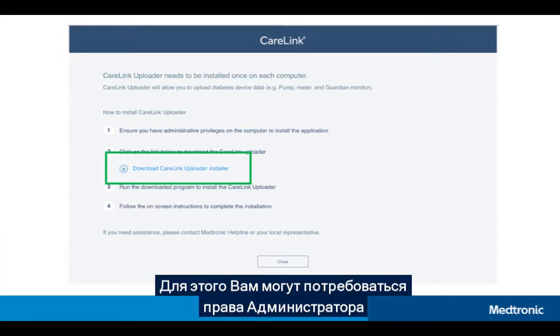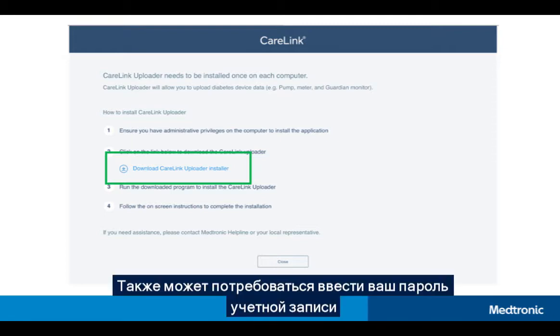You may need to have full access to change your computer settings, also known as administrator access. You may also be asked to enter your computer's login password.